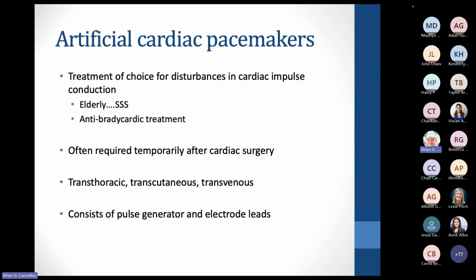And then we also have temporary pacemakers. So you'll see, like when you get to your cardiac rotation, that a lot of times those patients will have epicardial or cardiac wires placed for the first couple of days after having CABG or especially valve surgeries. And they can be used not only for bradycardia, but also for tachycardic rhythms. A couple different kinds of pacemakers we do encounter. What I was describing is kind of cardiac wires.